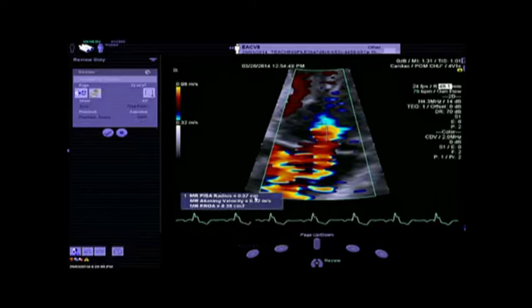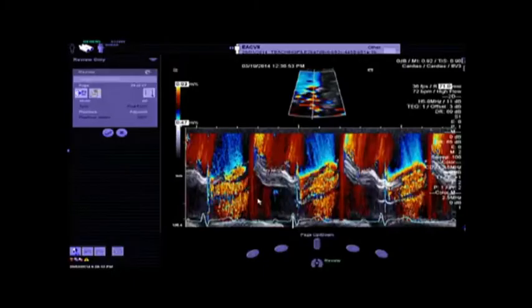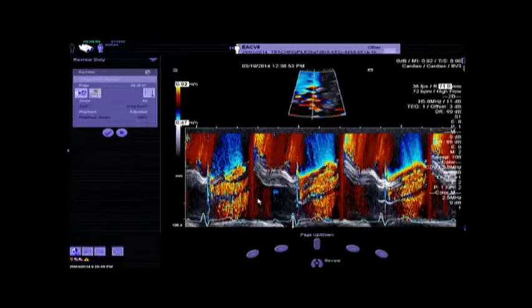So this means that the radius is high for the aliasing velocity. So what will be the next step to assess the severity of the mitral regurg? The first thing would be, of course, we need to measure the PISA radius. But be sure that the flow convergence zone is constant throughout the systole. And for doing that, you just need the color M mode across the convergence zone.